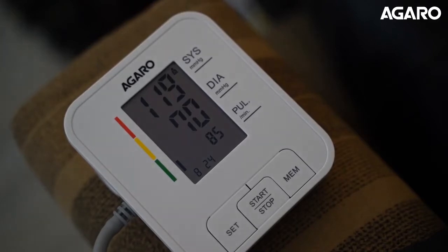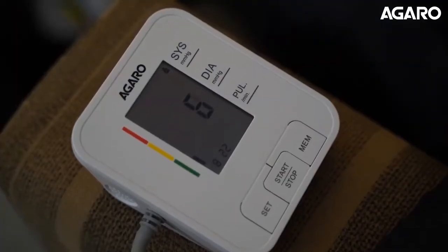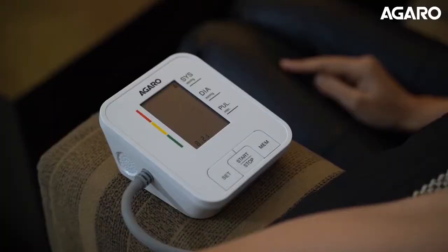Presenting the Agaro BP601 Electronic Blood Pressure Monitor, the perfect machine for your secure and reliable monitoring of your blood pressure. It comes with a clear LCD screen and is extremely lightweight and portable.